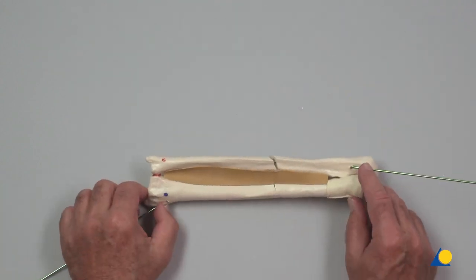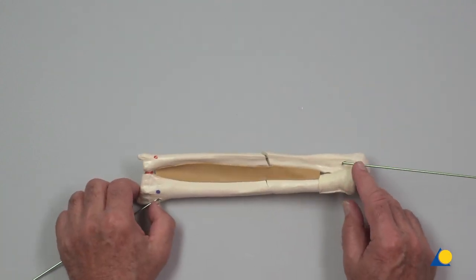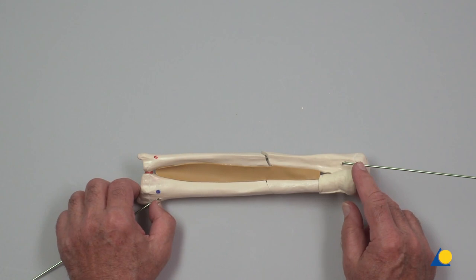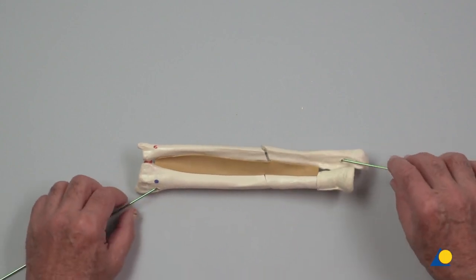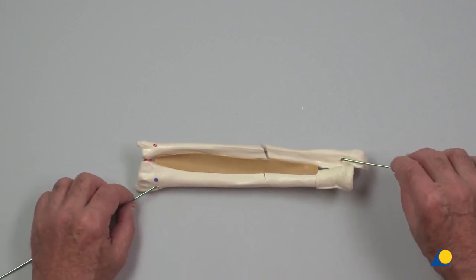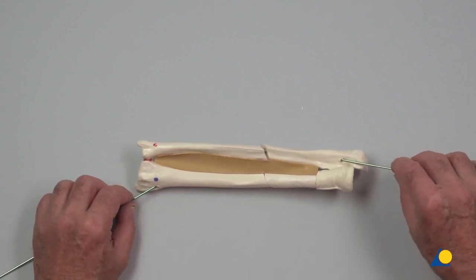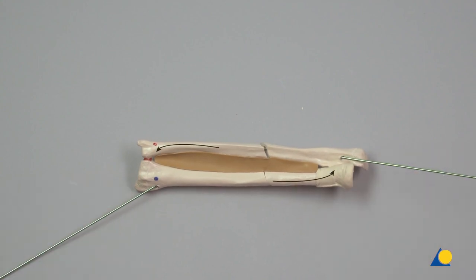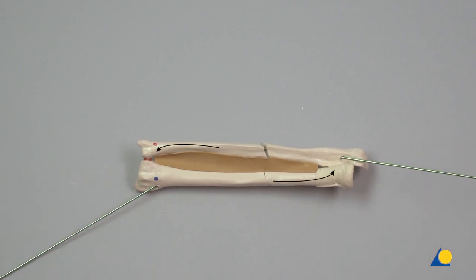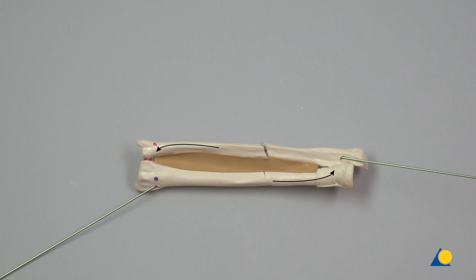Regardless of the chosen technique — radius retrograde, ulnar anterograde, or radius retrograde–ulnar retrograde — both nail tips must be rotated towards the interosseous membrane for maximum spread.